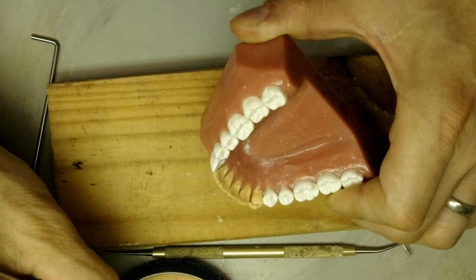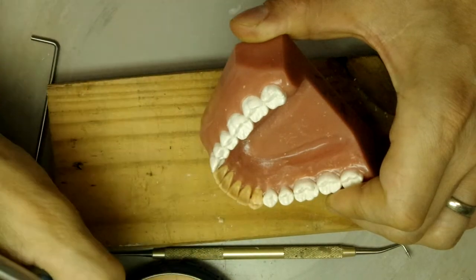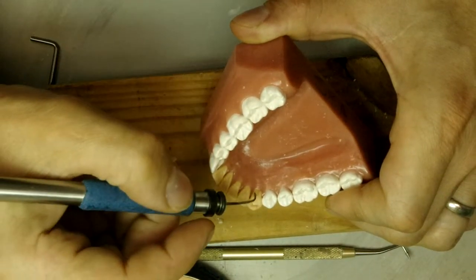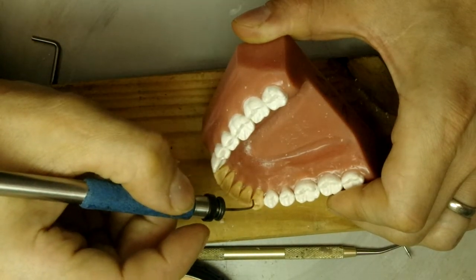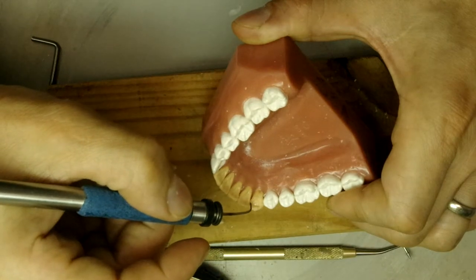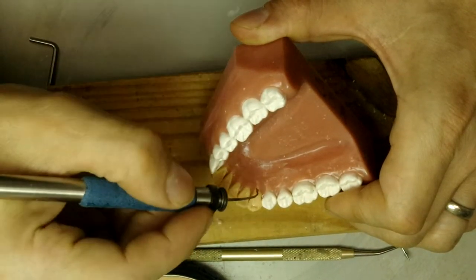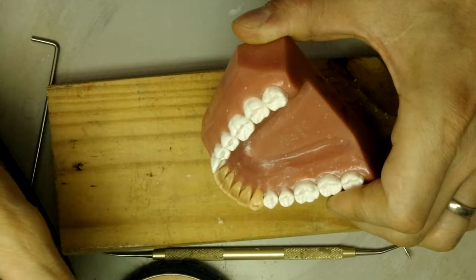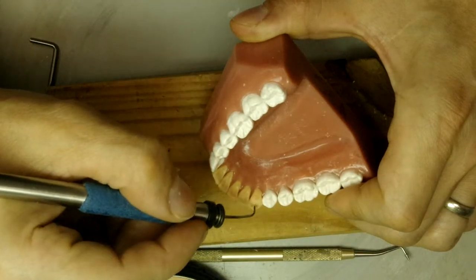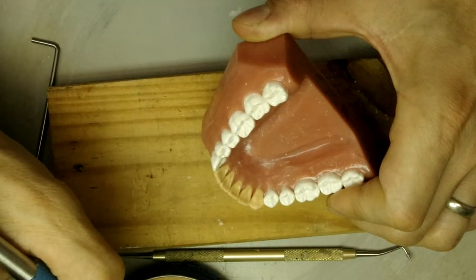Remember, when you're waxing the teeth, think what you're waxing. This way, the anatomy of the tooth structure will become internalized, so you'll be able to remember them. If you're just waxing without thinking, you're gonna end up not remembering the parts, number one. And number two, most likely you're going to overbuild everything, and then you're gonna have to start hacking away at the wax. And most likely you're going to break the wax. And then you're going to have to re-wax, and then re-wax, and nobody wants that, right?